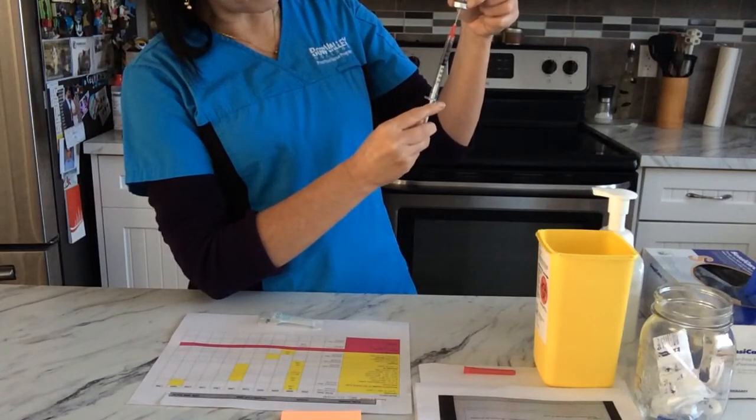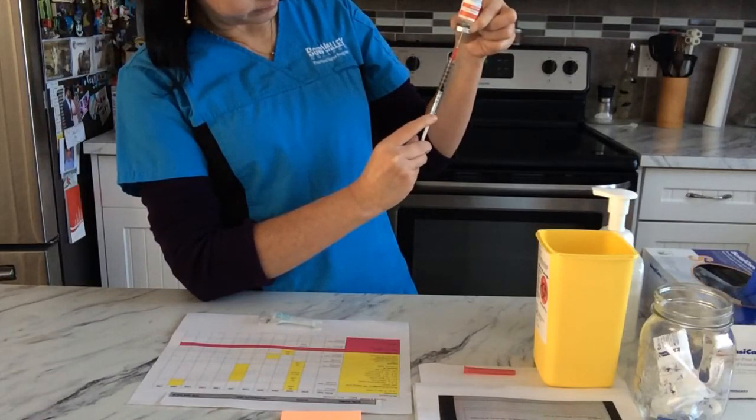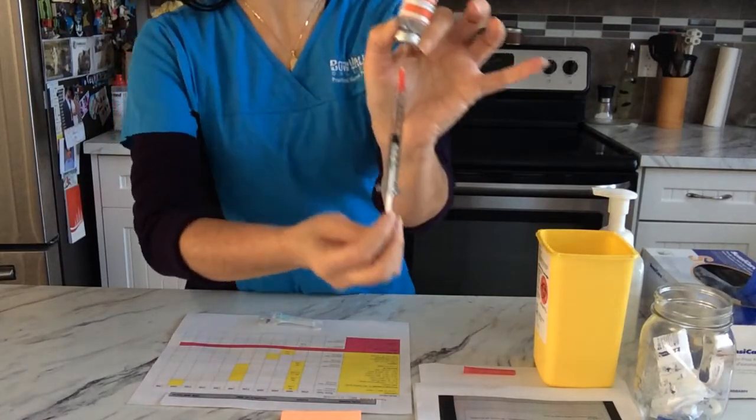Try to avoid bubbles. Okay, I have 0.5 without bubbles here.